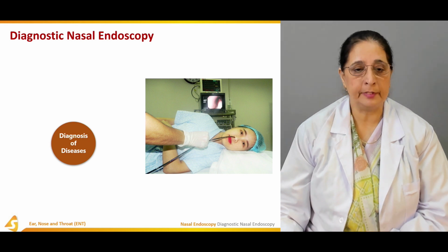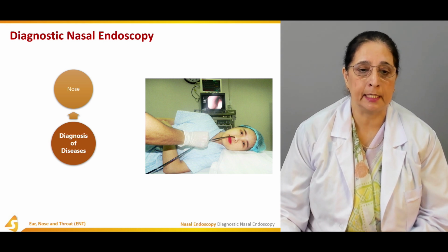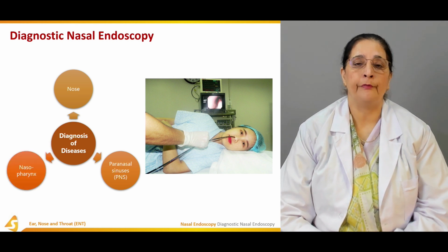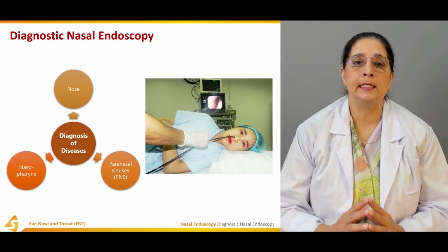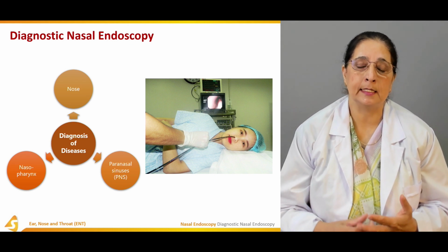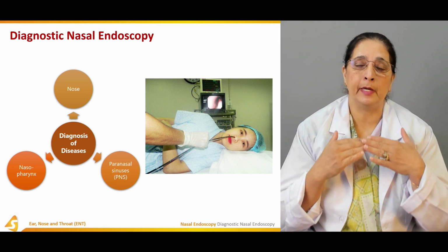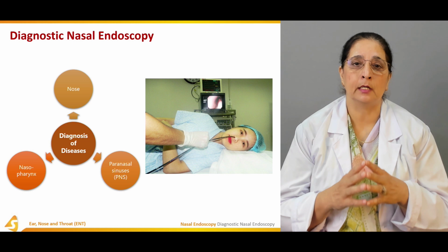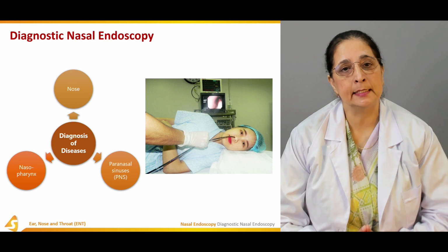We can diagnose diseases present in the nose, the paranasal sinuses, and the nasopharynx, which is the part of the pharynx behind the nasal cavity. Diseases limited to all these parts can be visualized by nasal endoscopy.